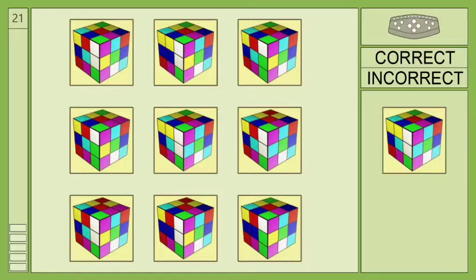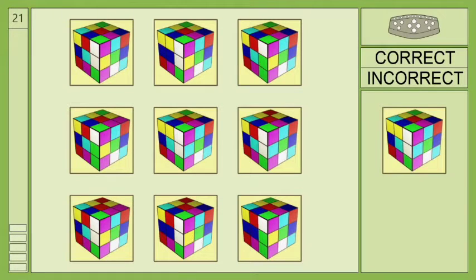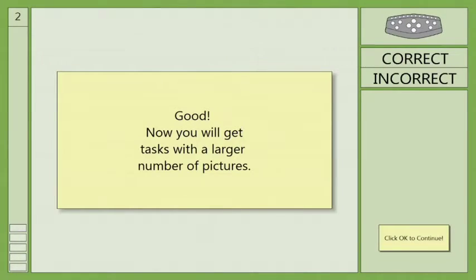RIHACOM works auto-adaptively. The difficulty level will rise or fall depending on the patient's performance. The performance bar illustrates this development. With each change in level, the user will receive additional feedback.